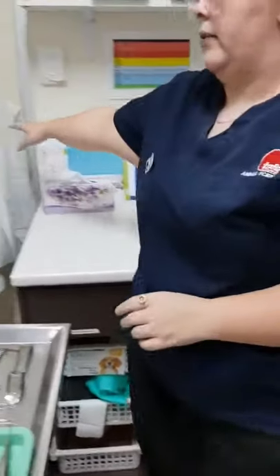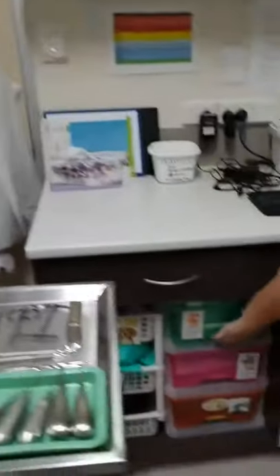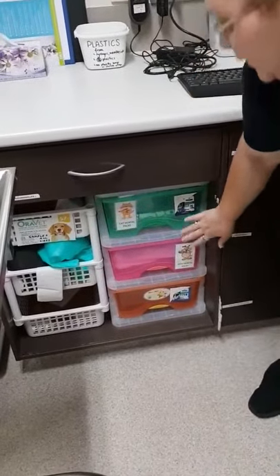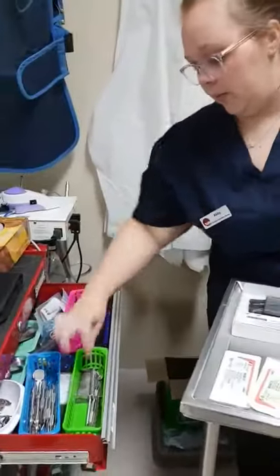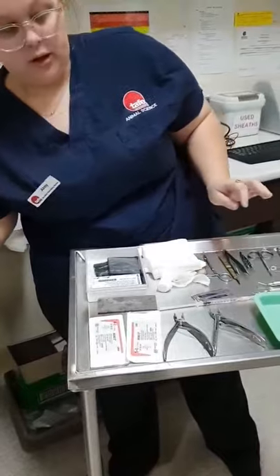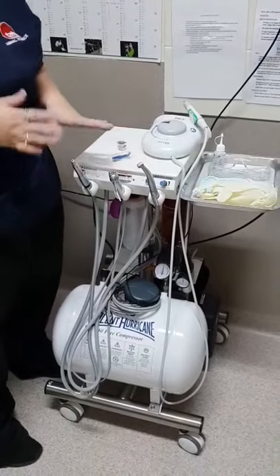We also have protective gowns for the vet and our x-ray machine leg gowns to protect them. We also have our dental packs that we send home with our animals — we have a cat and a dog version. For maintenance, we have a sharpening stone that we sharpen instruments between use, and for our dental machine, we oil all of the different heads, ensuring they're oiled every day.